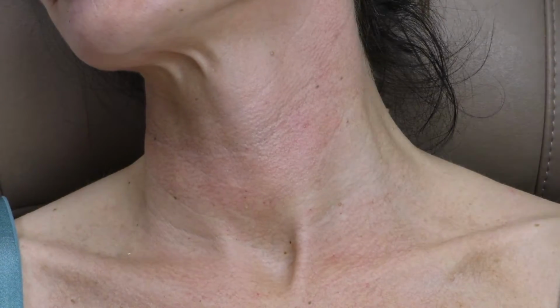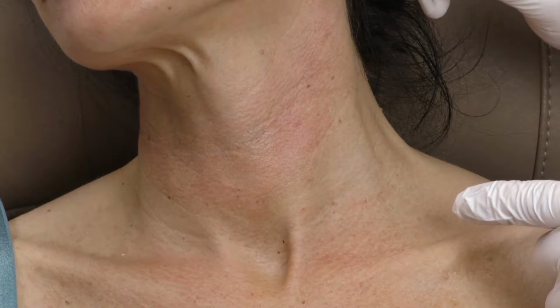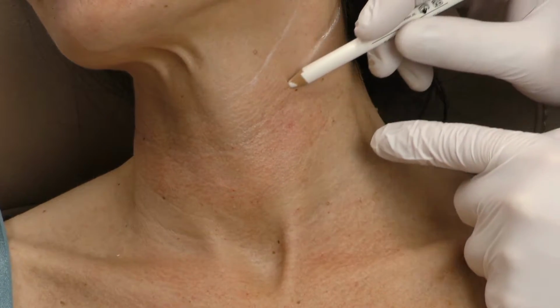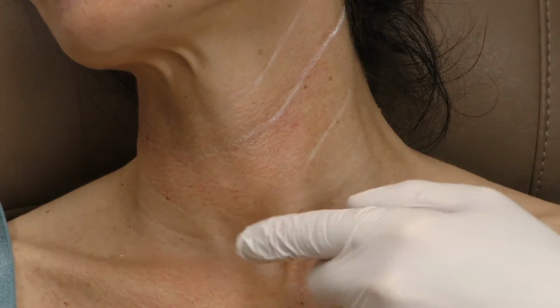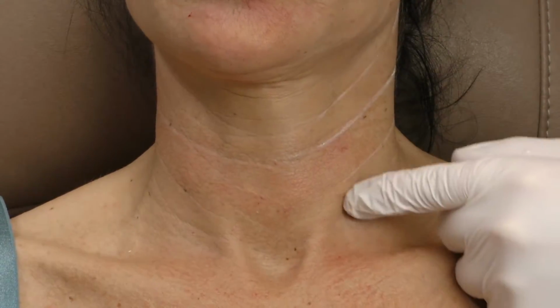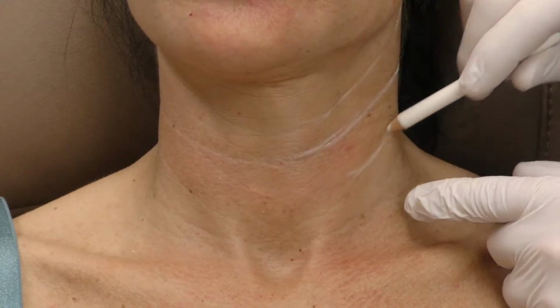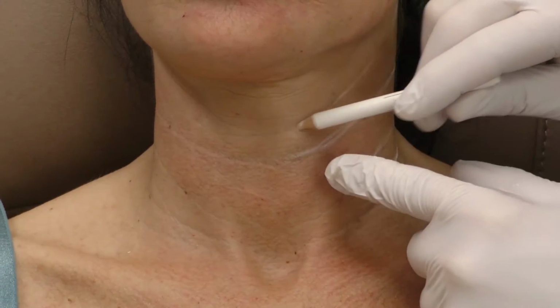Okay, we are going to look at the horizontal necklines. So in her case, they are quite long. They start from here and continue like this. And I see something here. Maybe you can put down your chin a little bit. Yeah, a little bit further. Yeah. So it's good to visualize exactly where you want to be. And as you can see, there's quite a number of them.